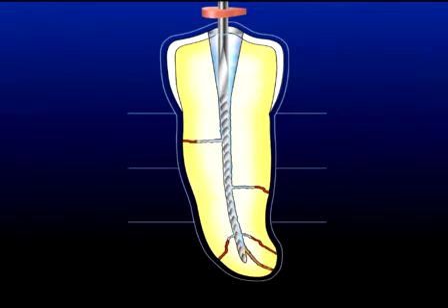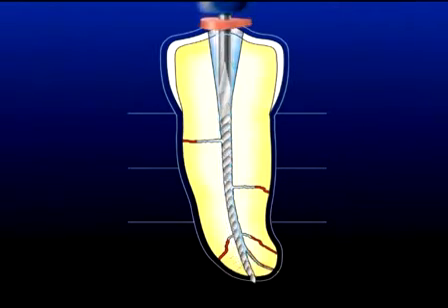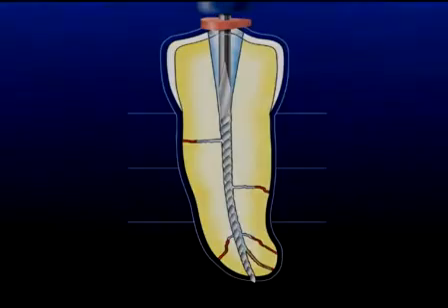Working arbitrarily short of the radiographic terminus in an apically blocked canal predisposes to a ledge. A transportation results because there's been failure to pre-enlarge the canal and occurs because carrying larger, progressively stiffer instruments to length begins to relocate the foramen on the external root surface. If persistent file grinding continues in a blocked and ledged canal, a perforation may result.